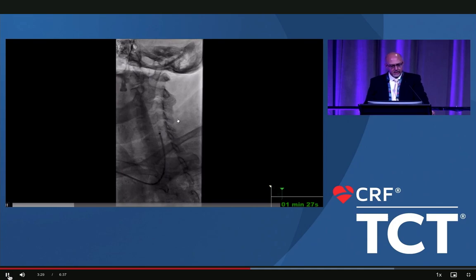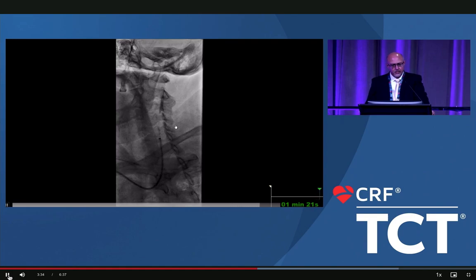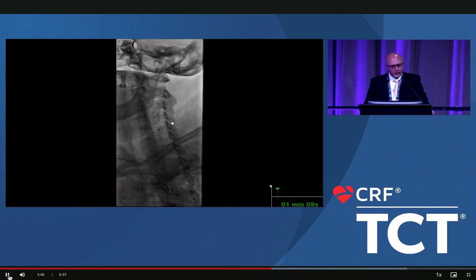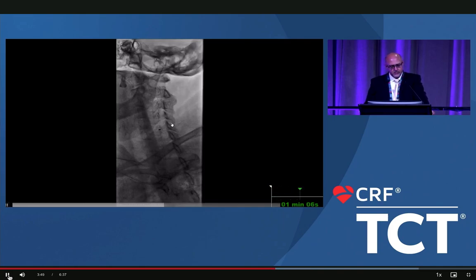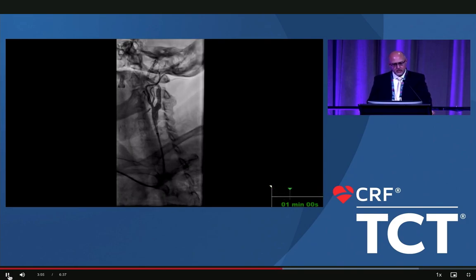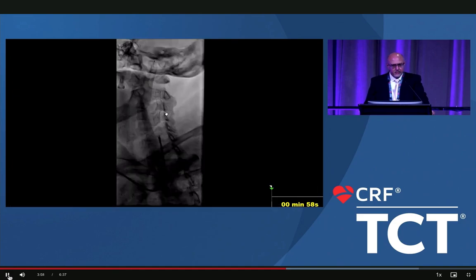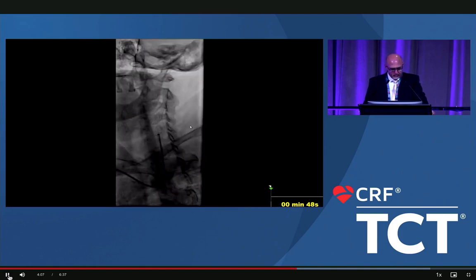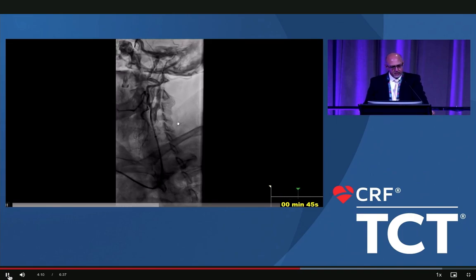Working over the Spider wire, I pre-dilated with a 4/0/30 angioplasty balloon. We then deployed a tapered 10-7/40mm dedicated carotid stent. That stent was post-dilated using a 5/0/30mm angioplasty balloon. The angiogram post-intervention showed a very good result at the intervention site. We retrieved our Spider without any difficulties. The repeat angiogram after retrieving the Spider confirmed the good result.